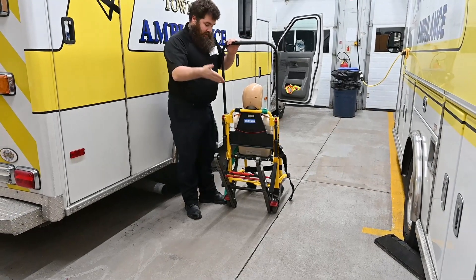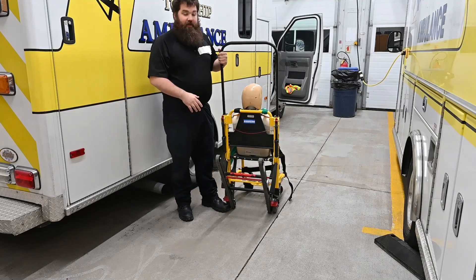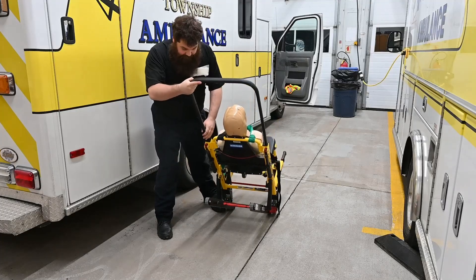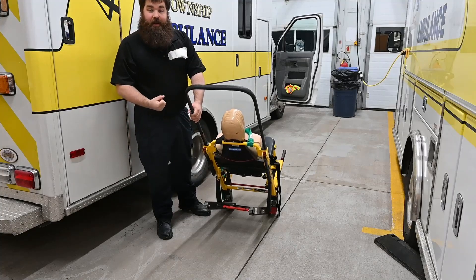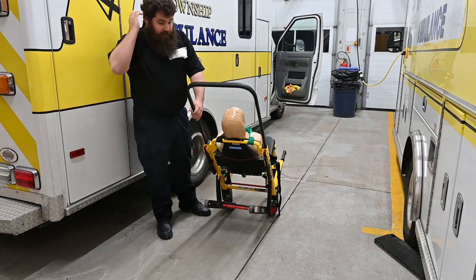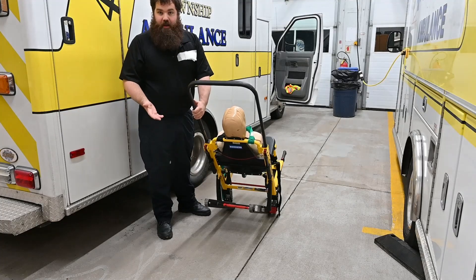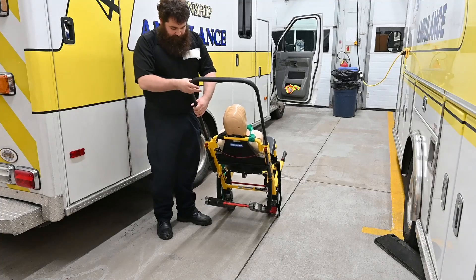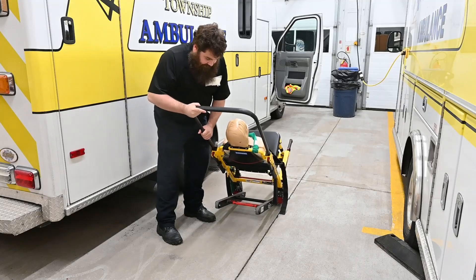We're facing the top of the stairs with the patient facing forward. We're basically going to put the patient back on the dolly — slide the patient back until they're on the tracks. The tracks will grip the stair surface; carpet is a little more slippery than others, but tile and wood steps work excellently with this system.